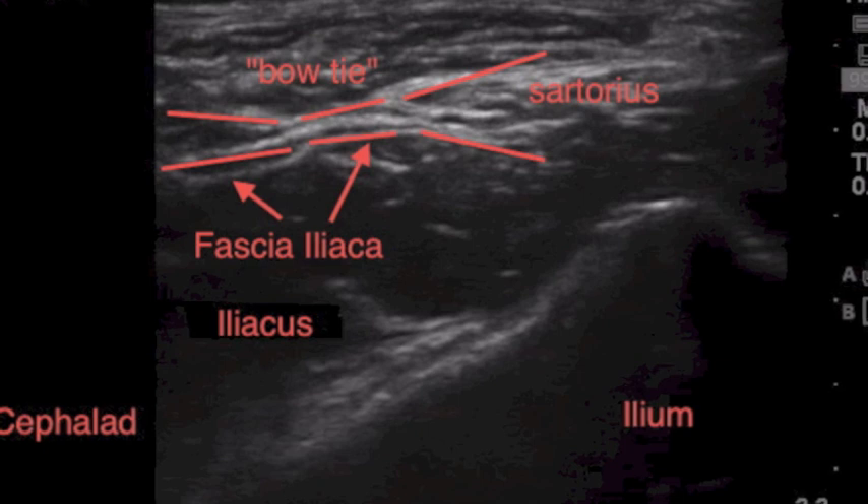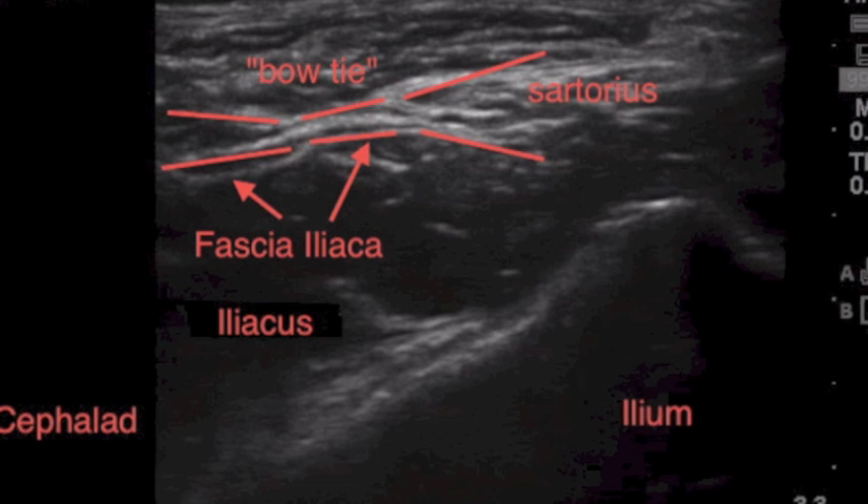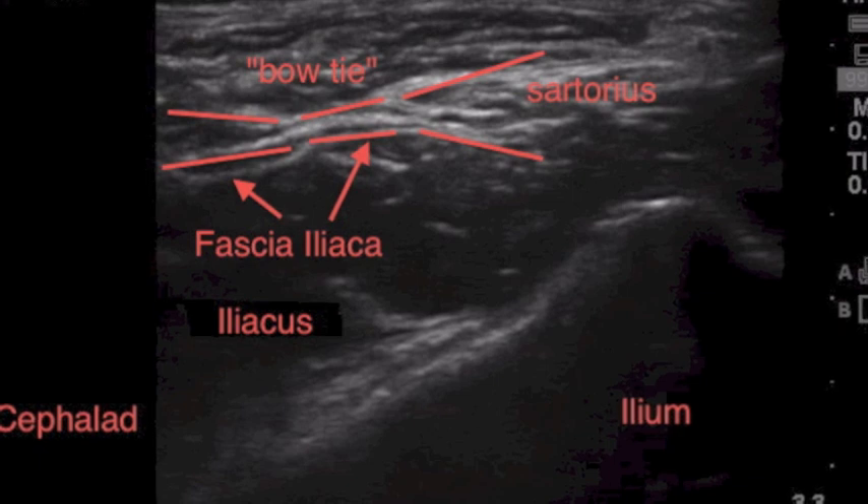From the Stanford School of Regional Anesthesia, in this quick tutorial video, we're going to go over the fascia iliaca block, which is an excellent block for hip surgery and frankly is quite easy to perform, but many individuals ask us about it because the view can be somewhat challenging.